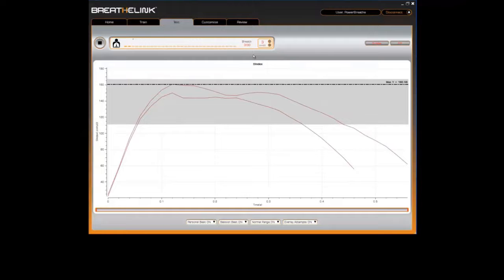Currently, you can see two linear plots on the graph. If you wish, you can show individual plots by switching the overlay option on or off. So, we've completed 2 breaths and we now wish to end the session. Click on the stop button.